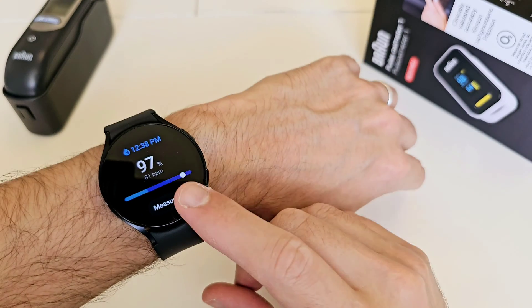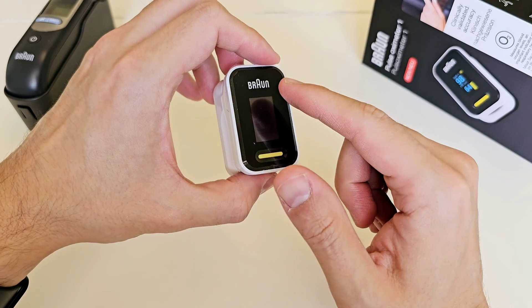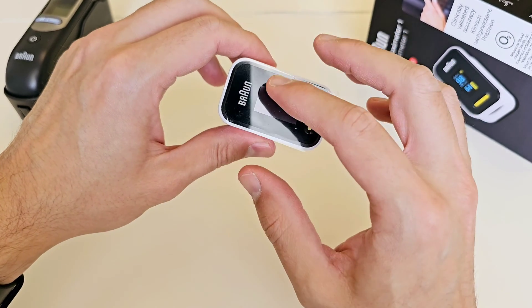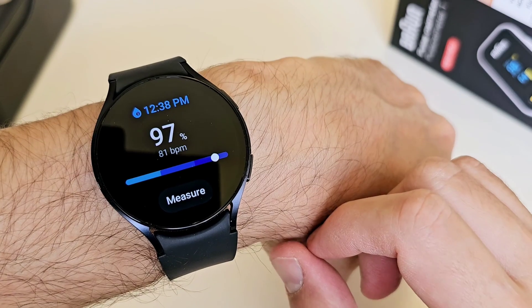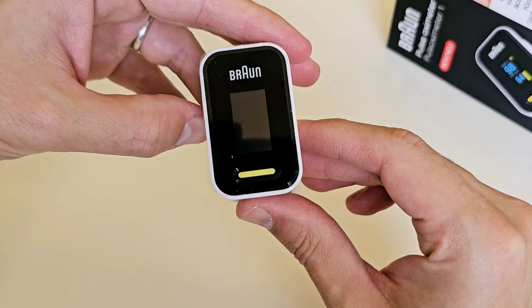Today I'm going to check the accuracy of the Galaxy Watch 6 against a medical grade pulse oximeter from Braun. This is the Galaxy Watch, so let's go ahead and check the oxygen saturation on the Galaxy Watch 6 against the medical grade device from Braun.